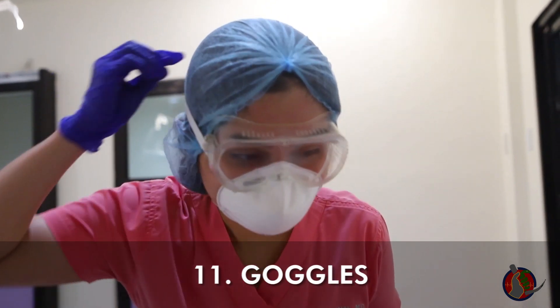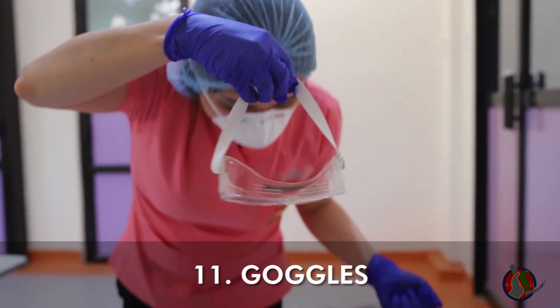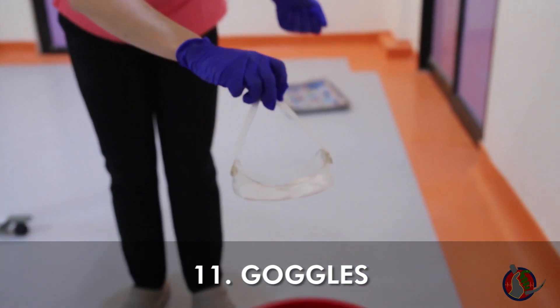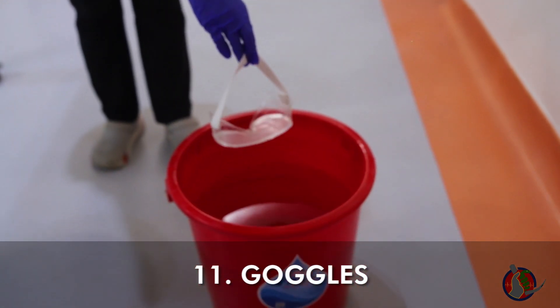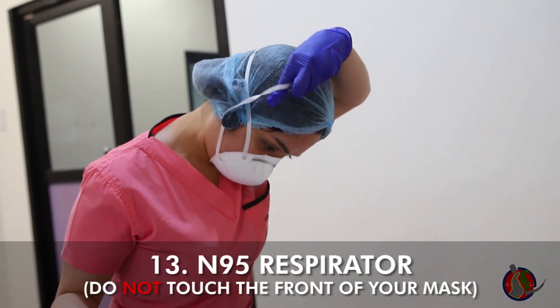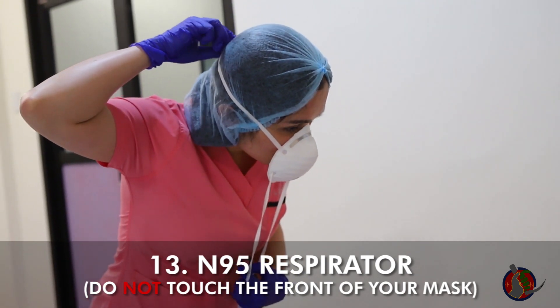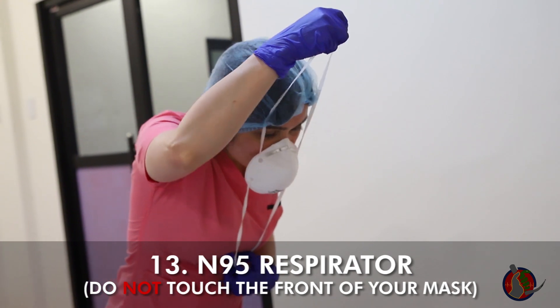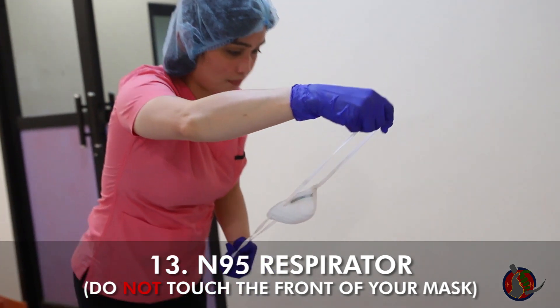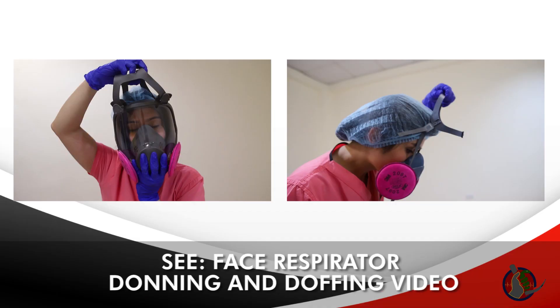Bend forward slightly, then remove goggles slowly from the back, touching only the straps. Skip this step if you're using the full face respirator or PAPR. Bend forward slightly, remove the N95 by releasing the lower strap first, keeping it in one hand at the front, followed by the upper strap with the other hand. Do not touch your mask. Throw slowly and carefully in the trash bin. Doff respirators at this step — see the face respirator donning and doffing video for details.